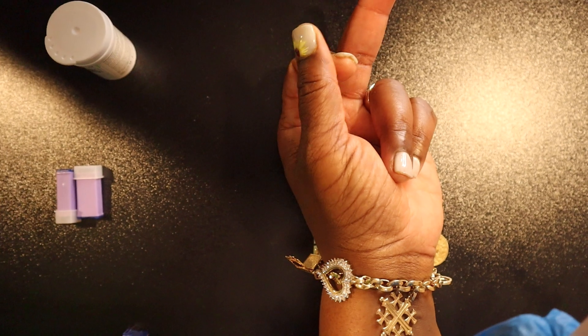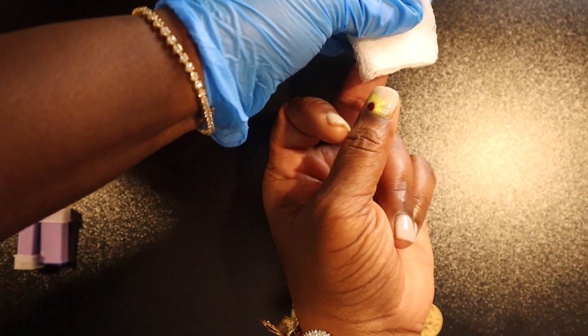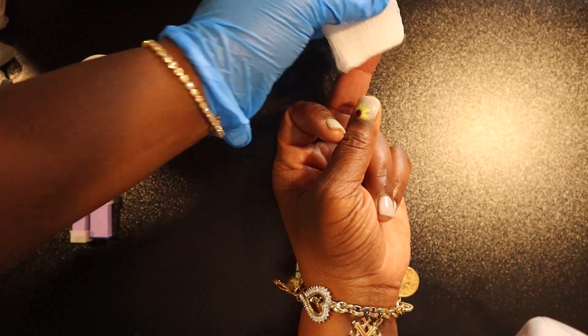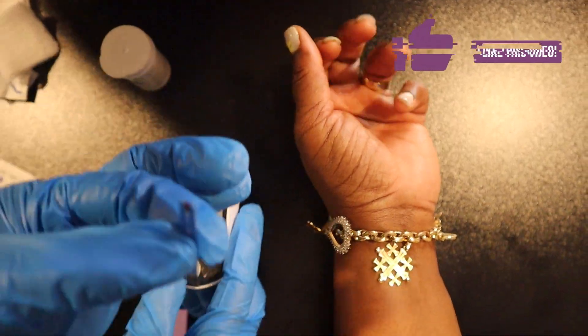If there is active bleeding, feel free to take a gauze and apply pressure to the site for about 15 seconds.